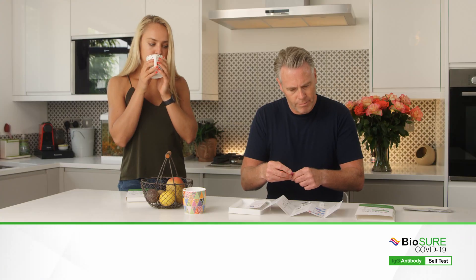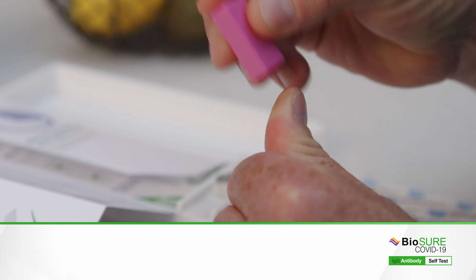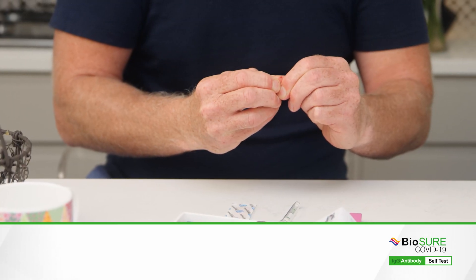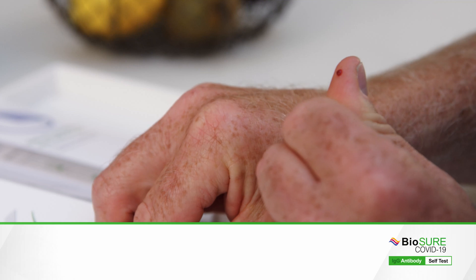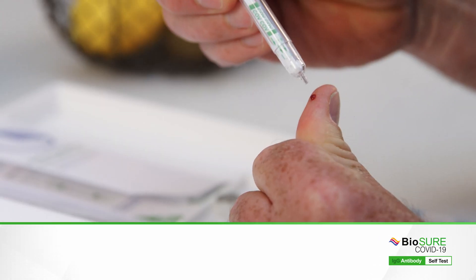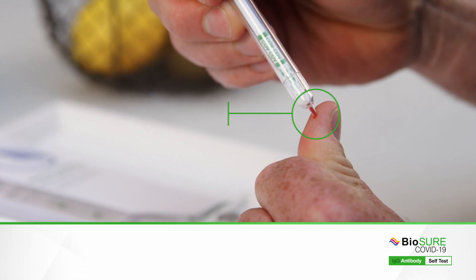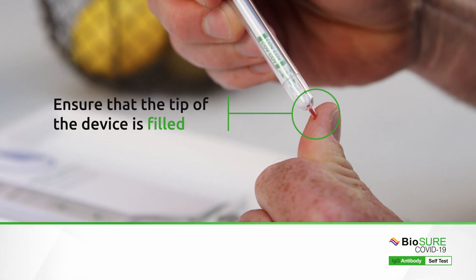Place the red pad against the side of your finger and press until the lancet clicks. You may need to gently squeeze your finger to form a round drop of blood. Touch the tip of your testing device into the drop of blood — it will automatically collect the correct sample volume. Ensure that the tip is fully filled.